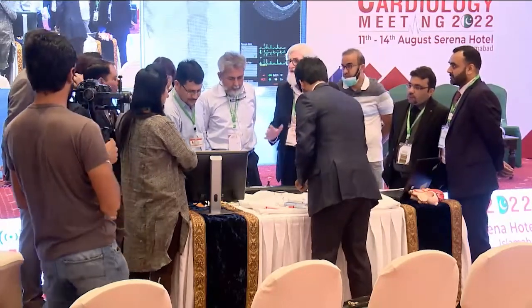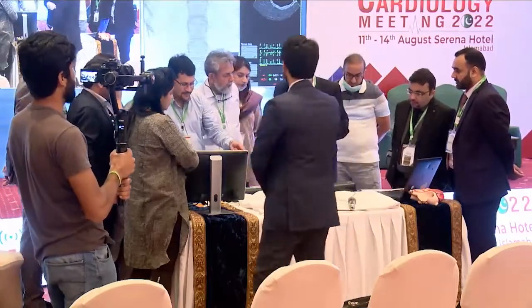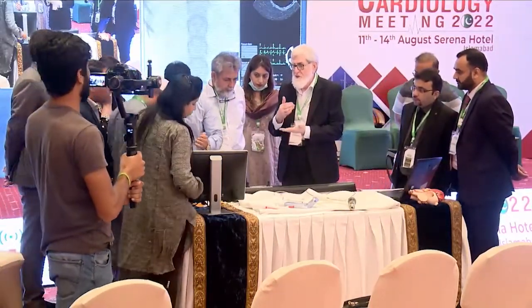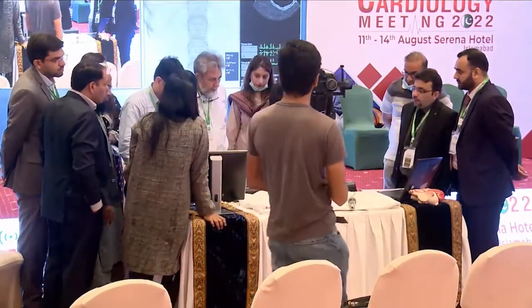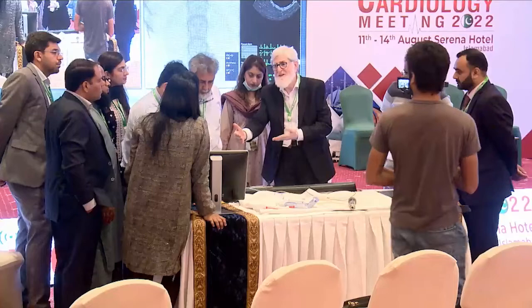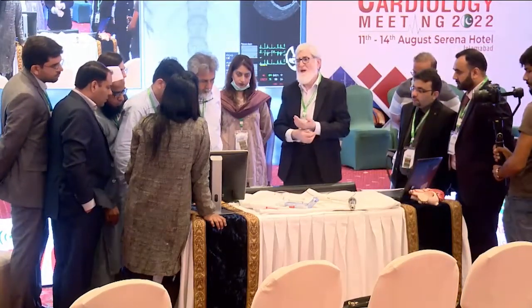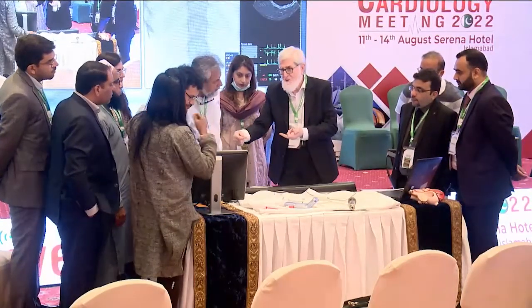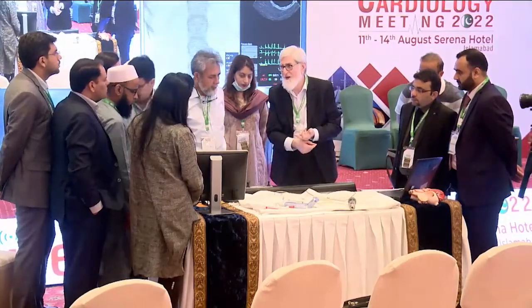Real life situation. The catheters are shaped like this, they are cut. If you go with the curved shape, it will not go into this, so this will only just detect the catheter. You put the one, you label it there. Suppose this is the guide wire. So it will take it as a guide wire and you go with the guide wire. Then next, you take the Mullins sheath, so it will take it as a Mullins sheath and you go with that and manipulate like this.